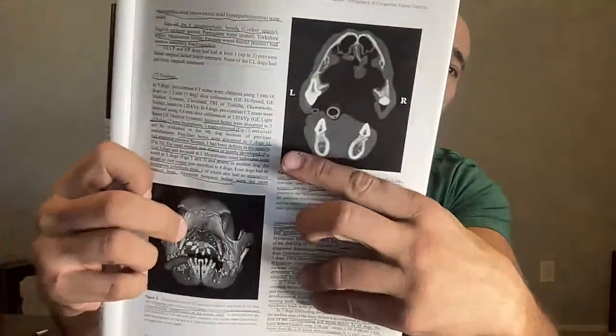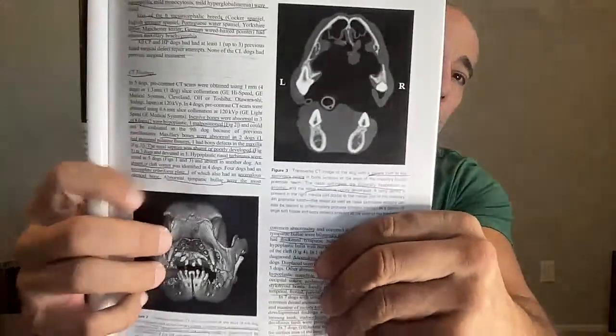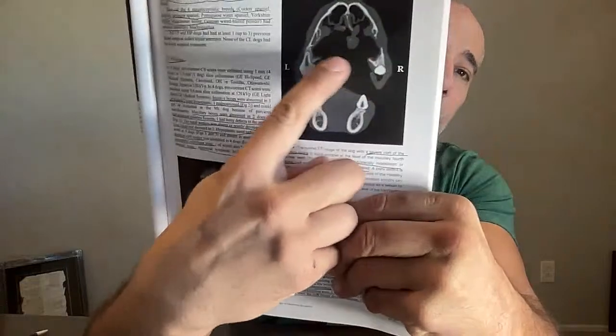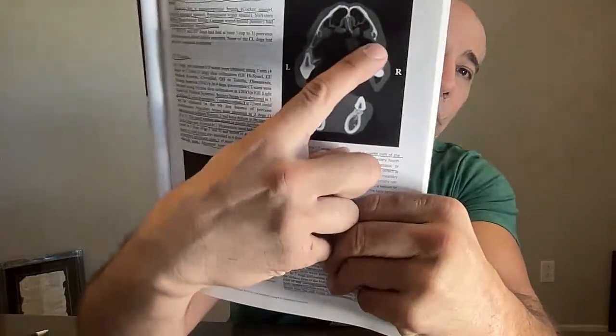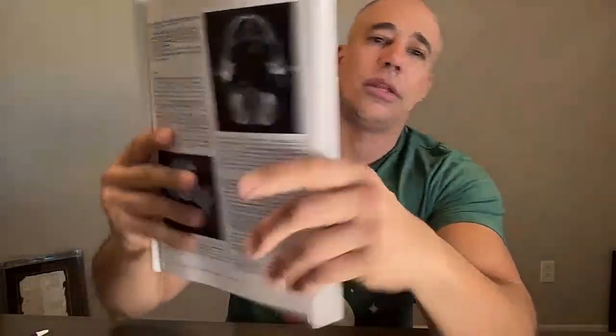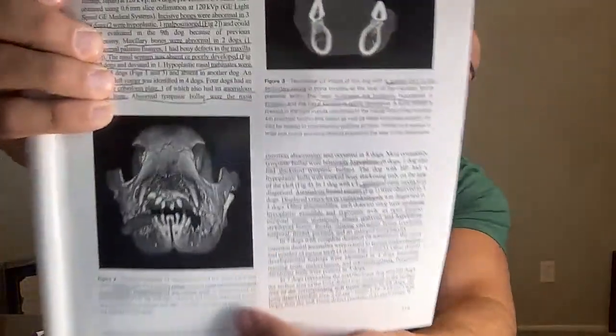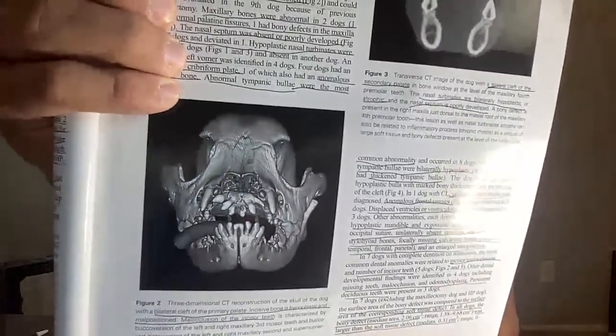All right, and then we have here this top view, this CT scan showing a severe gap. I mean, this dog has no palate. The soft and bony are gone, and it's missing portions of the nasal turbinates and nasal septum. And then you have a 3D reconstruction here at the bottom. So you can see that. You can notice a dental malocclusion in this dog as well.